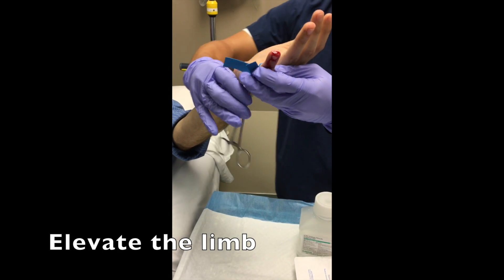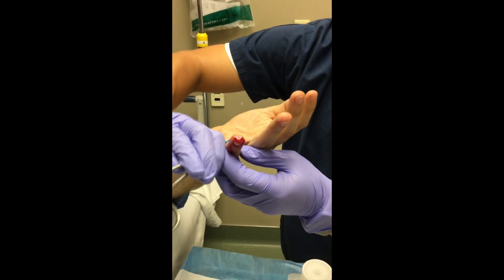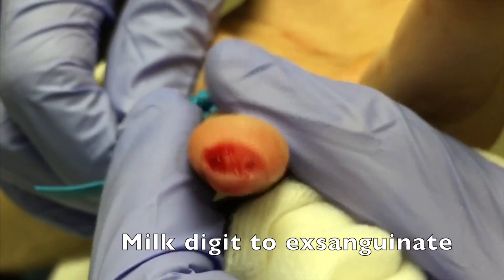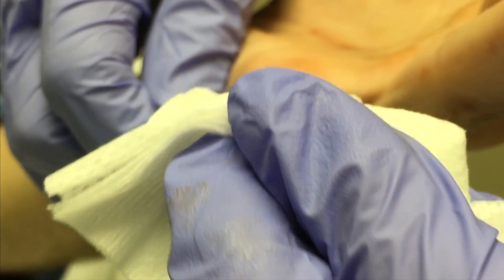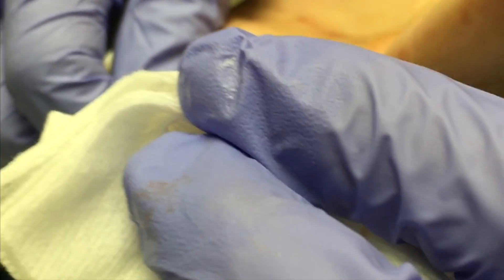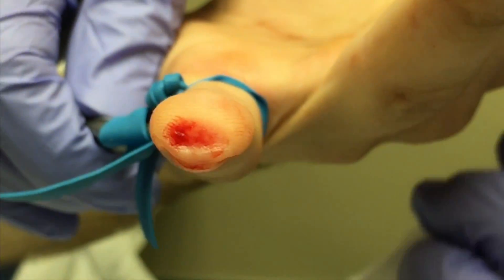As previously described, you're going to want to elevate that limb in order to decrease regional blood flow. Another important step is to milk that digit from proximal to distal to completely exsanguinate it and decrease the risk of bleeding while the glue is drying, which can ruin the procedure.